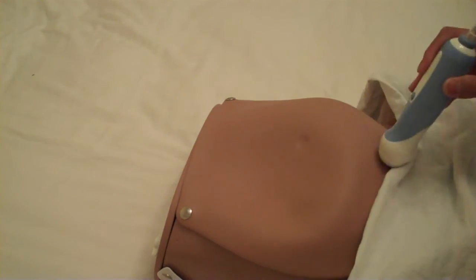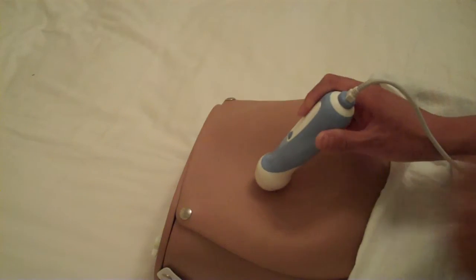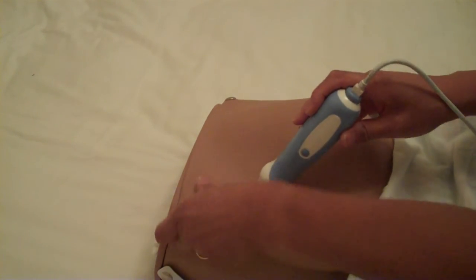Okay? So let's say you're scanning and you get a certain picture this way, you turn and you get a different picture this way, and then you can figure out how the baby is positioned. If the baby is lying this way, this way, this way, or this way. Okay?